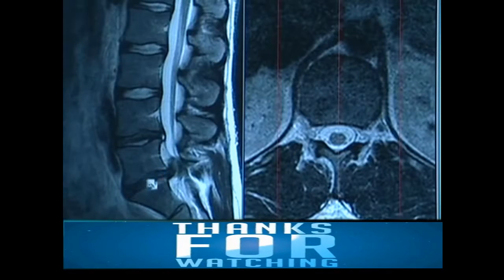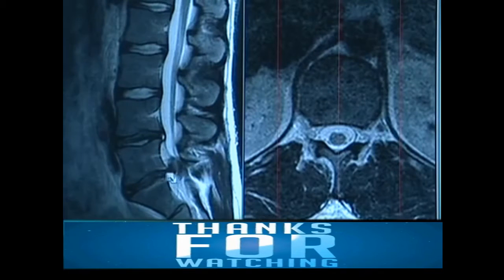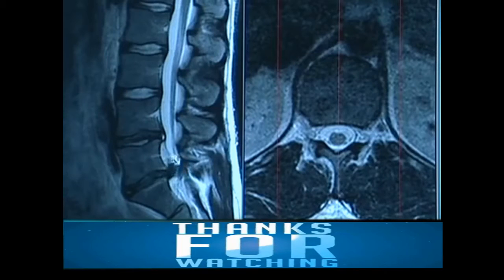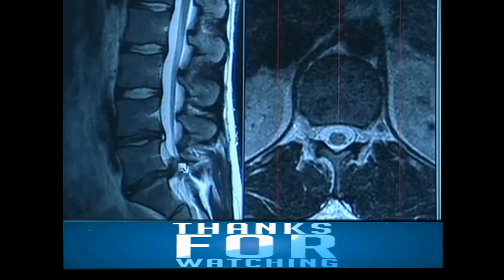At the L5-1 level, it looks somewhat like the L4-5 level — the disc is dark — but you can see a complete rupture of the back of the disc and a disc herniation here, which is filling up the spinal canal. This is a typical disc herniation.